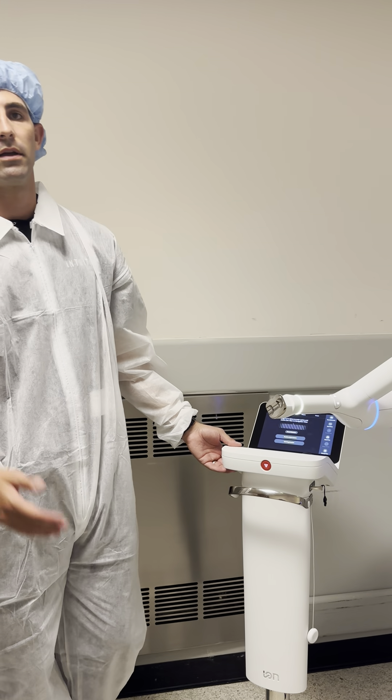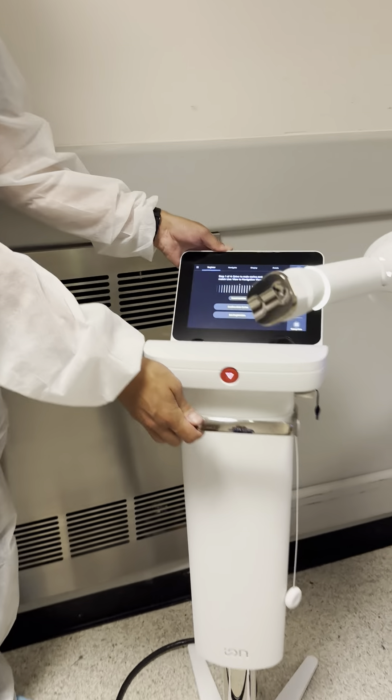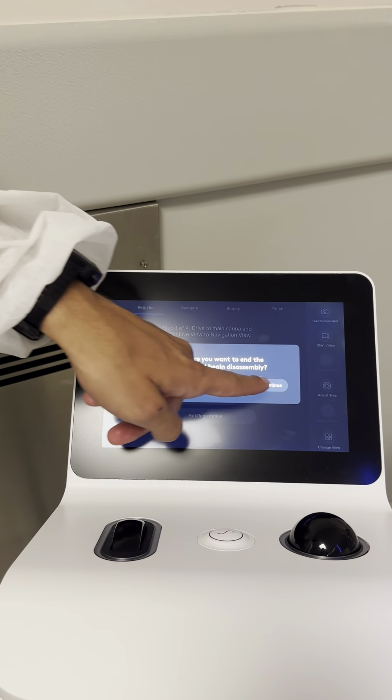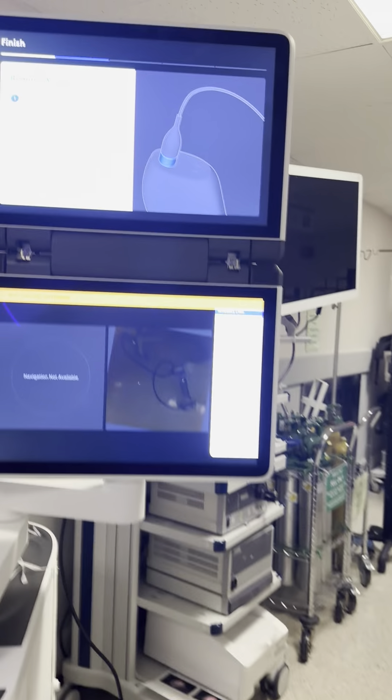After the case is over, sometimes the physician will walk out and you won't click the finish button on the controller. It's right here. If that's the case, we'll just click finish, continue, and you want to go to disassembly. Now you can see that disassembly will show up on the screen.